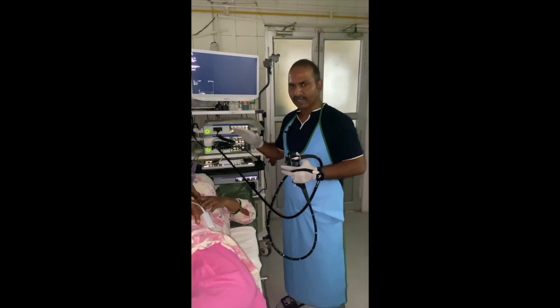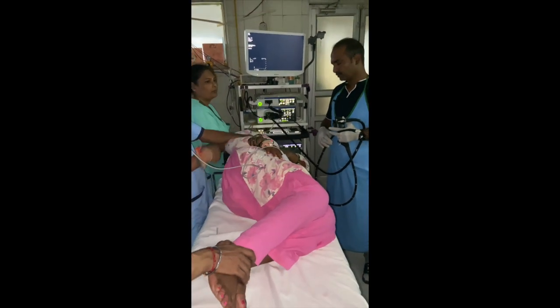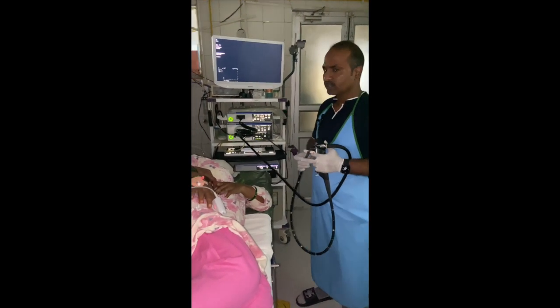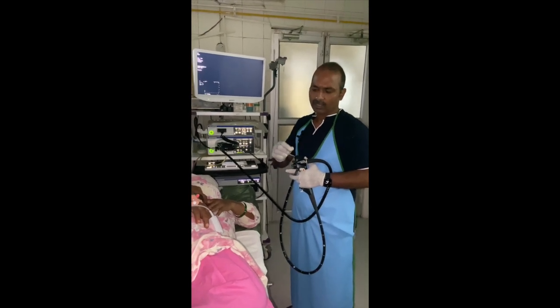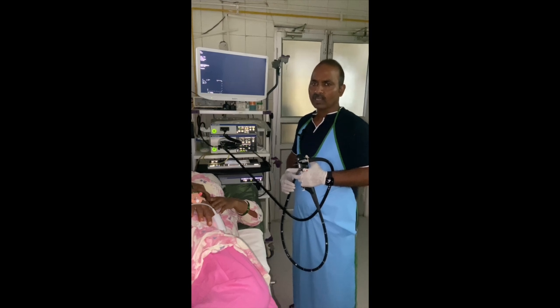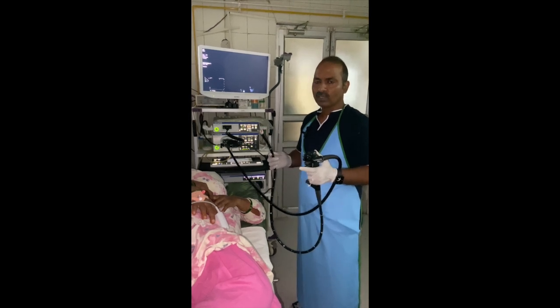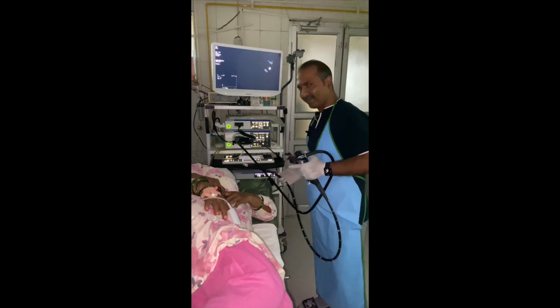Patient is sedated, and we are going to introduce the EUS scope. Before insertion, one should keep in mind that the probe end of the scope is a little bit longer than the routine ERCP scope. So the insertion should be gentle, not forceful, and the movement of the up and down knob should be towards the down, so that we get the curvature of the pharynx.